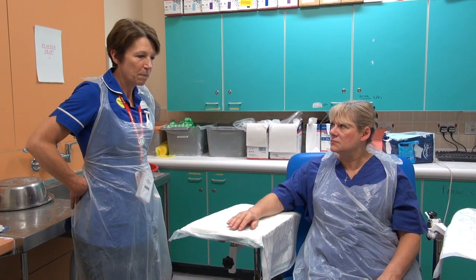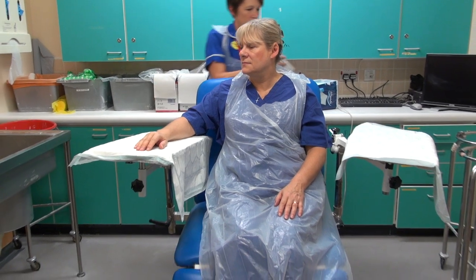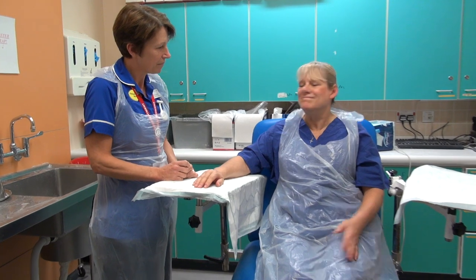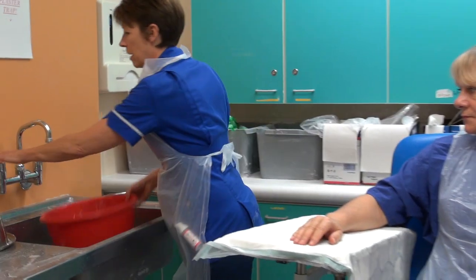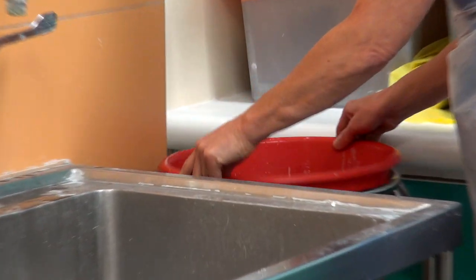We also need to think of our backs when we're doing any sort of plastering, so we're just going to raise up the bed if that's fine. I'm also going to check that Mag has got no ring on her finger, which she hasn't. So I'm going to get all my equipment ready. I need some lukewarm water here, and I'm going to bring that close to the patient.